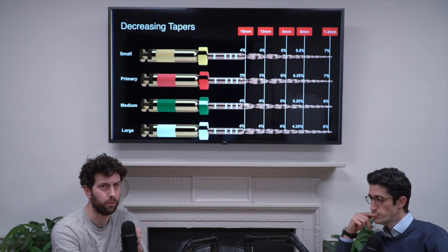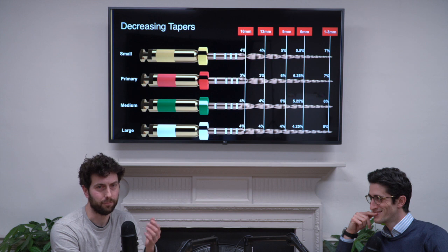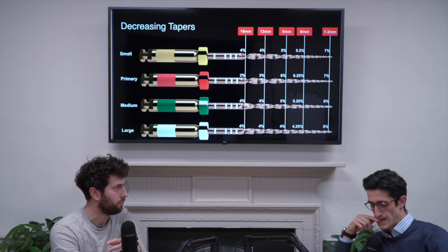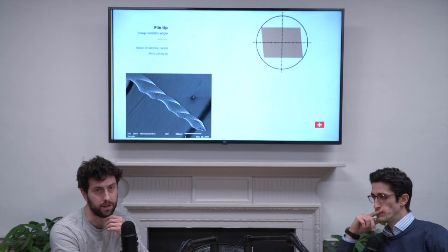Everyone gets really hung up on the D16 diameter is 1.13 millimeters, like we've got here with the primary, versus the ultimate, which has got a 1.0 millimeter. You use them in entirely different ways. So you're not going to cut that shape. It's going to be bigger when you're brushing, for sure.